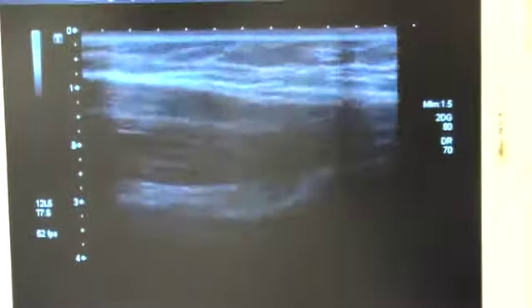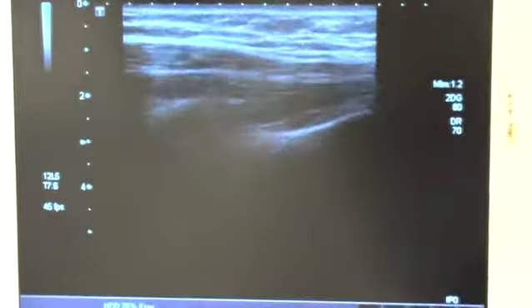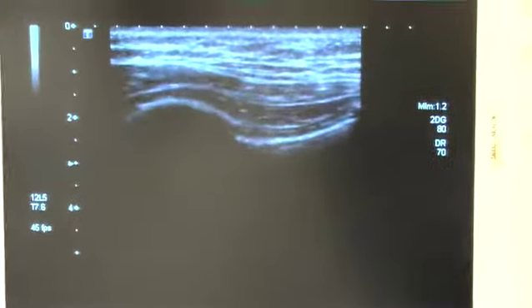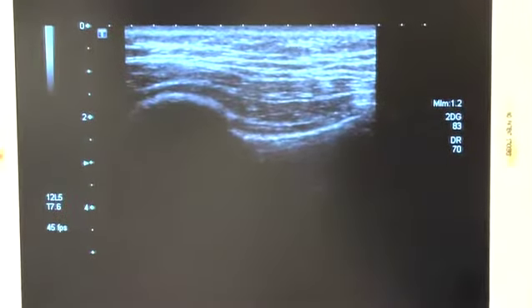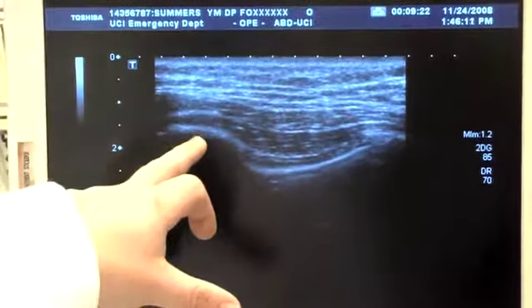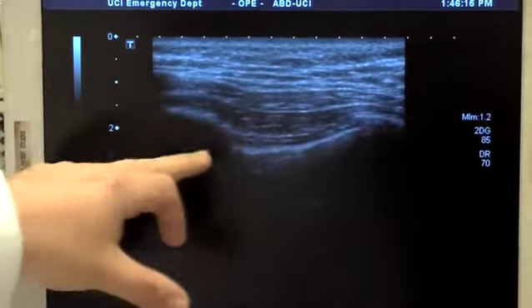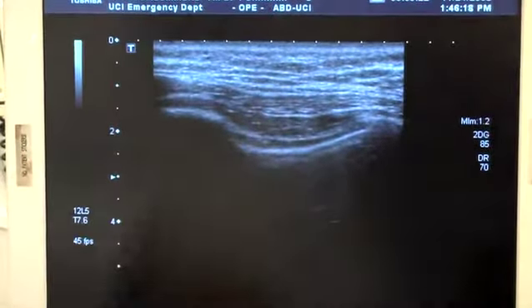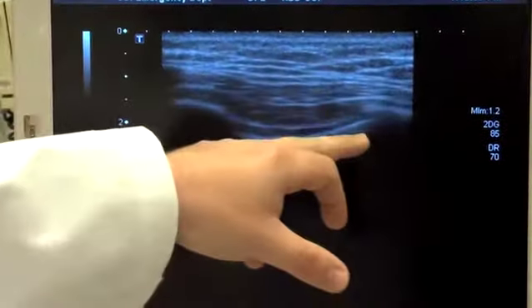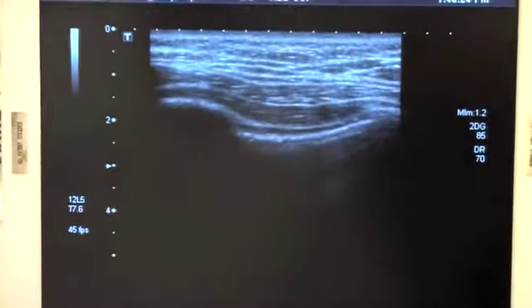Now my picture also seems a little uniformly dark, so I might change my gain a little bit, turn it up a little bit. Okay. And just to point out the anatomy, this is the second rib, this is the third rib, and this is the intercostal space. This brightly echogenic line just underneath the ribs, in between the two, is the pleural line, where the visceral and parietal pleura rub together or slide against each other.